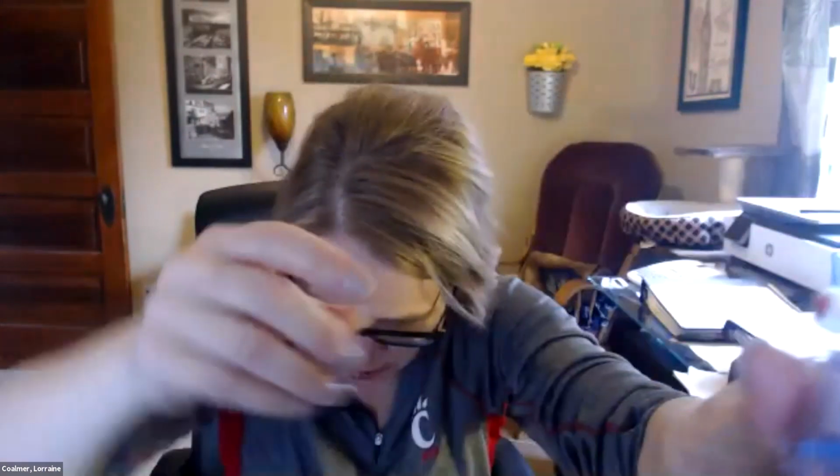So once I have this open to air, I go over to the monitor and I hit a button. That button says 0, and all my numbers go down to 0 on the screen. I know that it's okay to use. Then I put the stopcock back here, and I put the cap back on here, which I lost on my desk. Okay, so that is the transducer.